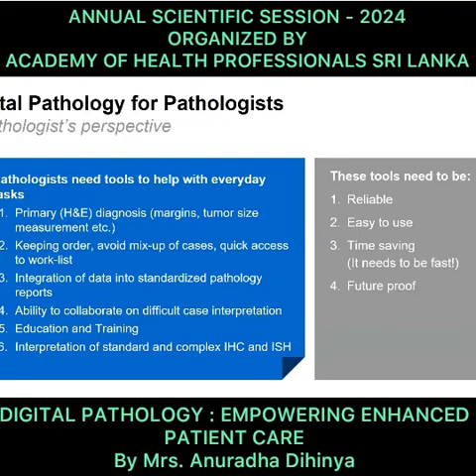Now, coming to digital pathology from the pathologist's perspective, how is it helping them in their everyday tasks? It helps pathologists because they can work remotely and do their primary diagnosis. When I'm talking about looking at the primary diagnosis digitally, they are looking at the slides on their computer monitor, where they can take care of their margins, tumor size and measurements, all on the digital scanner platform. Then they can also avoid the mix-up of cases and anything which needs to be reported urgently.